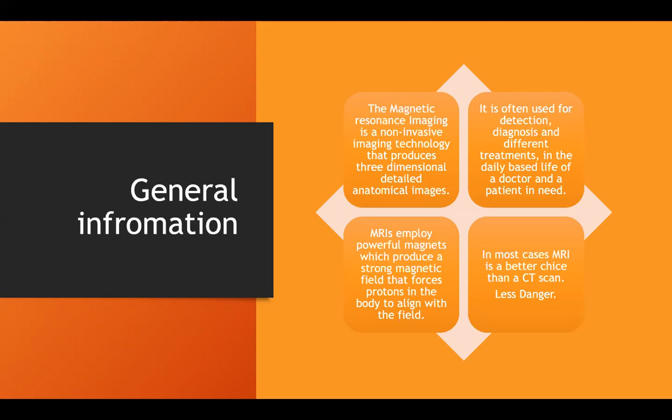So these images can be like if you have ever broken a bone and you go and look at a scan image, that is an anatomical detailed image. But MRI is more about body tissue. So for a look in the lungs or other tissues in the body that have a problem, it's easier for the doctor to examine the damage or the problem in your body.